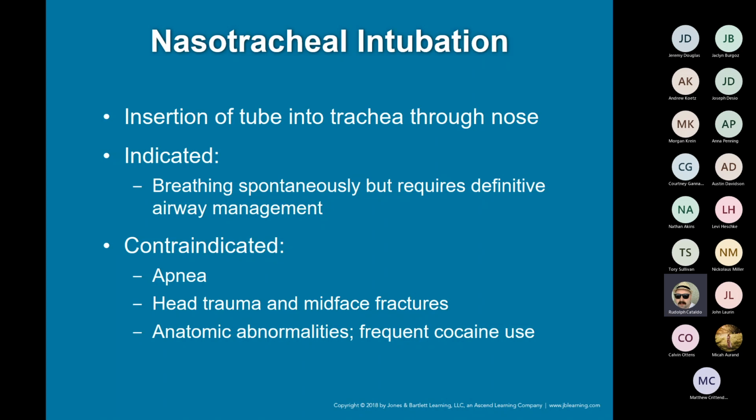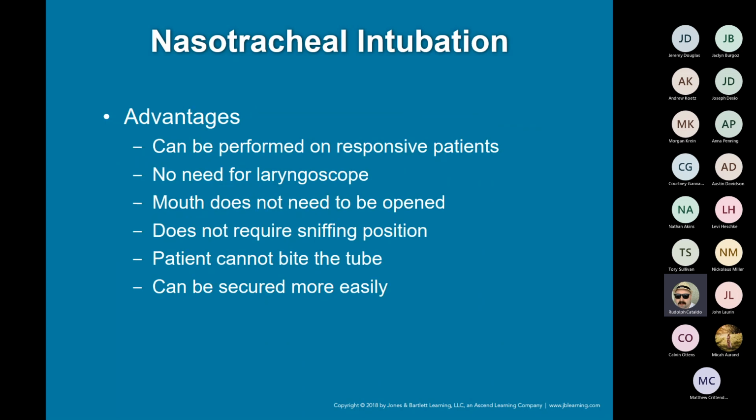So I'm sure it has its place in the clinical setting. In EMS, if you're just responding to 911 calls, it might be a different story. Maybe you're doing critical care transfers, taking somebody from one level of facility to another. You could potentially see nasotracheal intubated patients, but as far as what we're dealing with, it's not going to be common. Again, it can be performed on responsive patients.